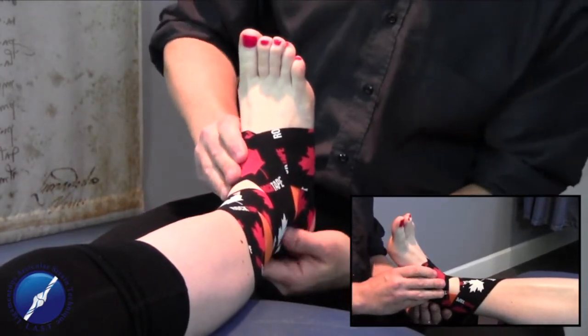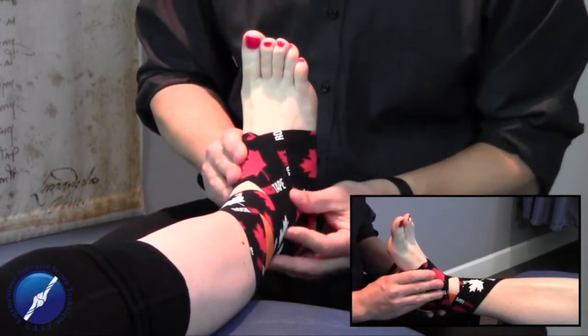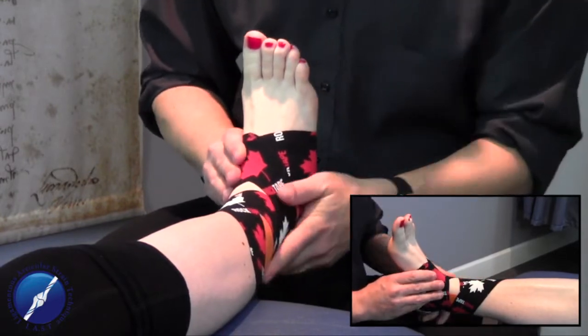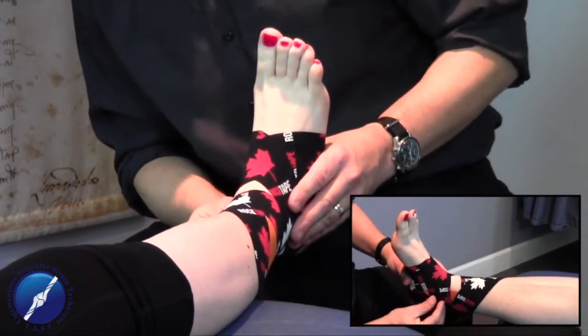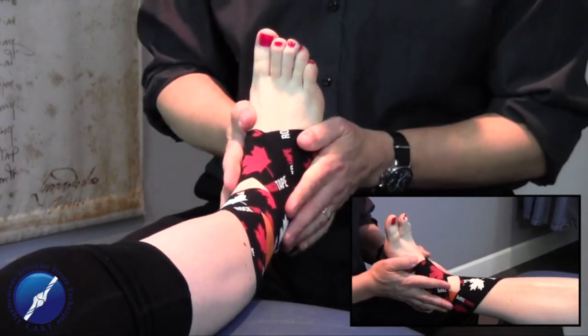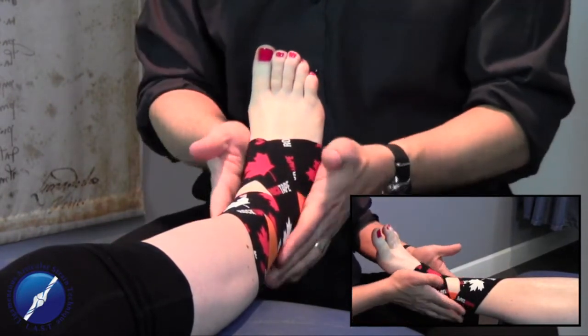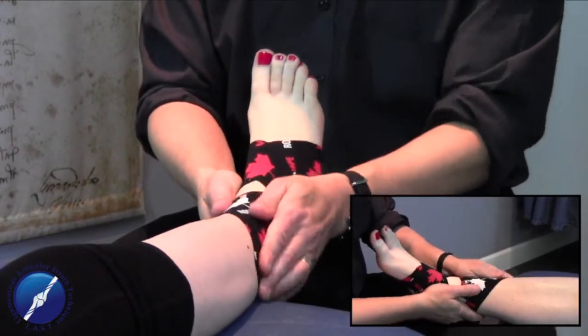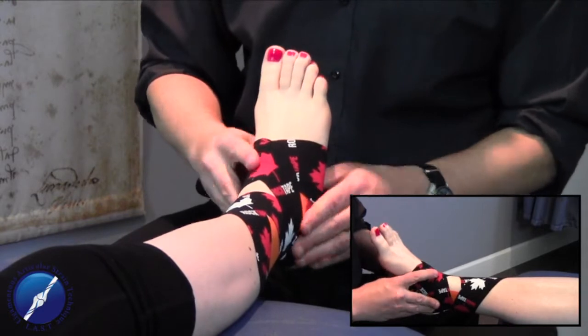We've got a nice amount of stability happening on the lateral aspect of the foot, some neurological engagement for the peroneals, and some nice stability for the medial aspect of the foot also. If we let her foot relax and go down, it's nice and stable, in a neutral position. This is a great application that we can send our patients home with.